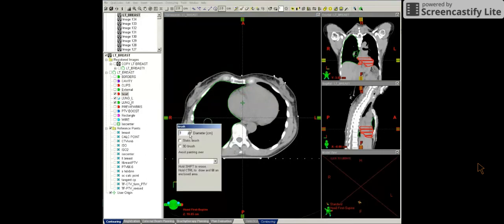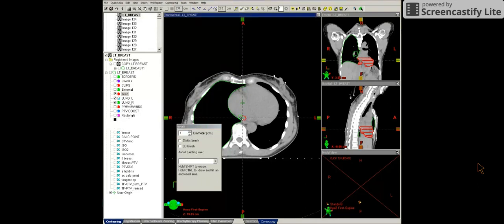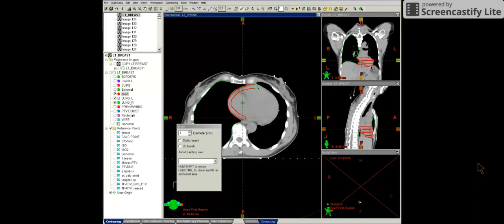And let's go ahead and contour this slice. So I'm going to use the paintbrush tool. I'm going to keep the static brush turned off. So this way this paintbrush knows the density and will stay within the heart tissue as I contour. As you can see, I'm just outlining the heart here.